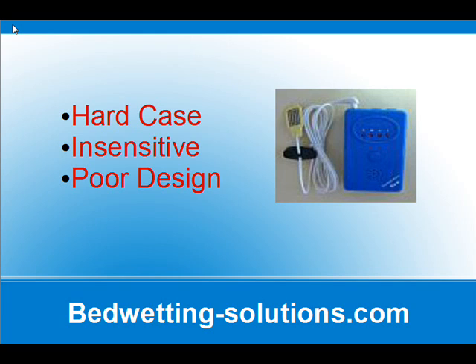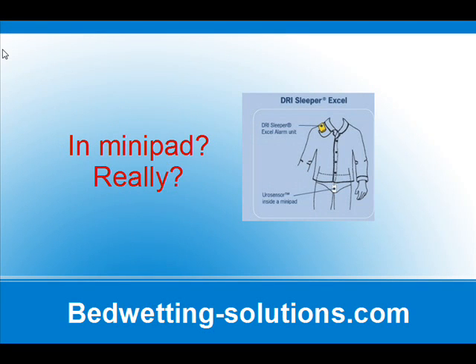The only way I've seen of using those in-pant sensors is to insert it into a mini pad, and that's kind of awkward at 3 o'clock in the morning. Alternately, you could tape it on the outside of the underwear or sew pockets on underwear. The idea is to catch the first few drops of wetting without encountering sweat.